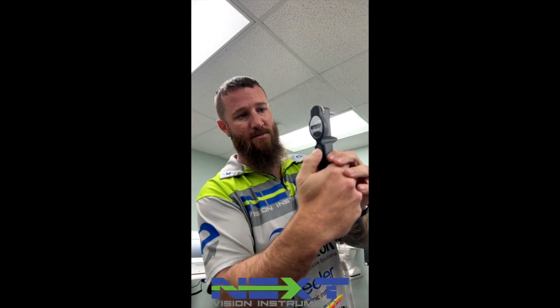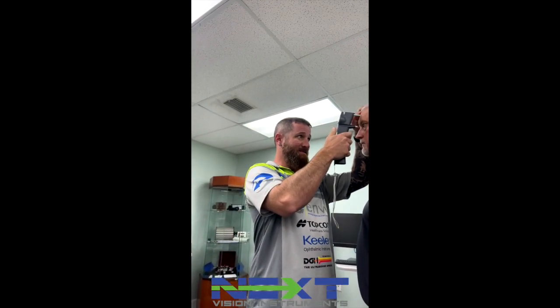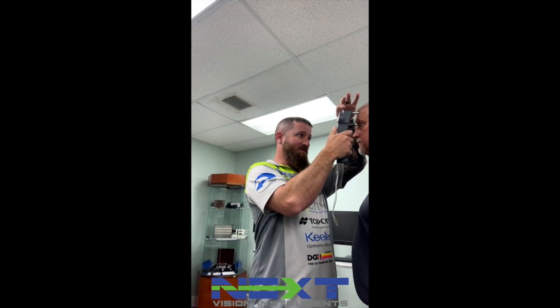I click this button and we're ready for measurement. I'm going to have my test patient come over. I'm putting this on his forehead — it's a little farther away.